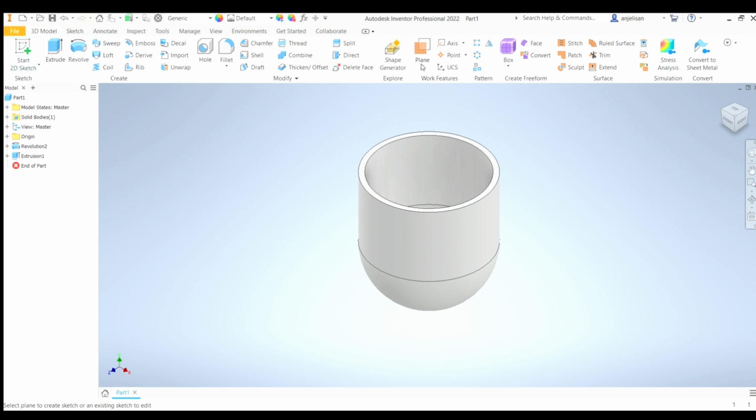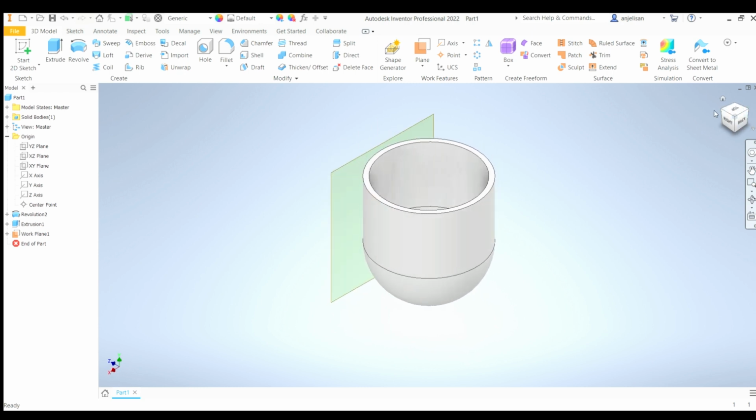So what we have to do is create a flat plane to allow for the sketch to happen. So again, go down to plane, tangent to surface and parallel to plane. We want it to be tangent to this very curved surface. That means we want our plane to touch at one point of it, but at the same time, we want it to be parallel to the XY plane, for example. So what it does, you'll see here, it does exactly that. It's touching the curve at exactly where we want it.